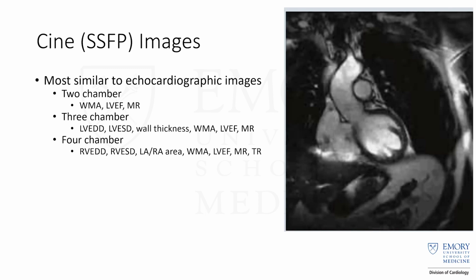And so patients, depending on how slow or fast their heart rate is, depends on how long they'll need to hold their breath for, and what image acquisition you're trying to get determines how long the breath holds have to be. You have to keep that in mind when you're imaging patients.